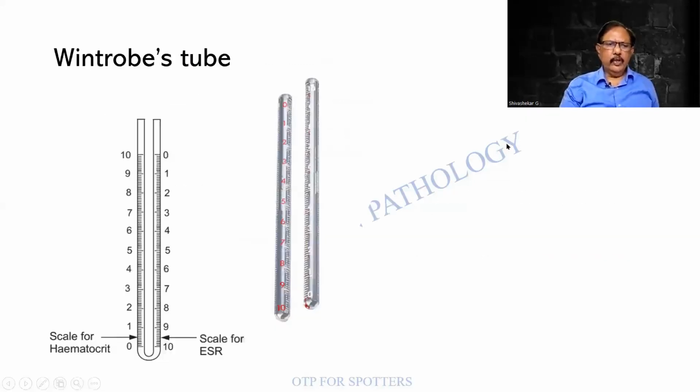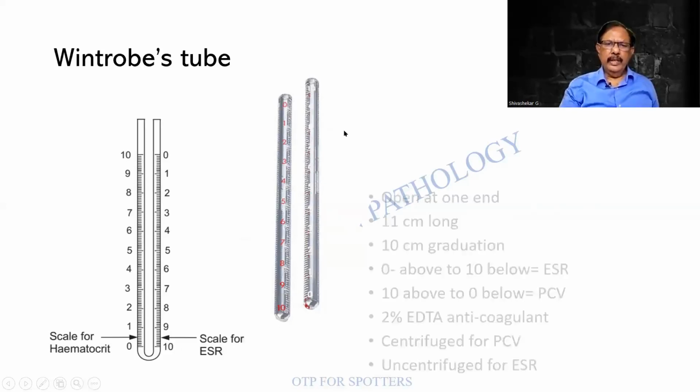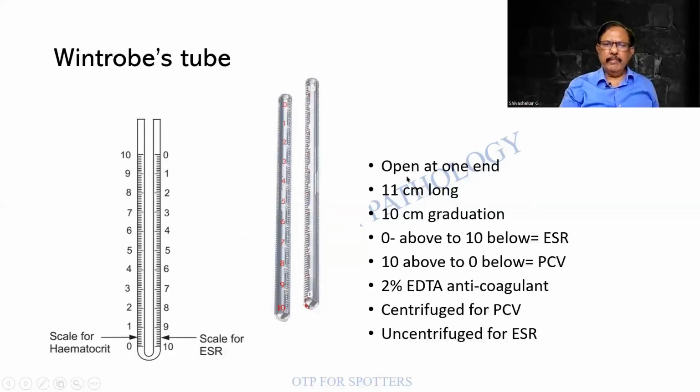So this is another tubular structure. If you are very careful, you will observe that there are two sets of readings over here. 0 to 10 is for ESR and 10 to 0 is for hematocrit or PCV. This is what you people will be seeing. There are the graduations and the tube is quite narrow. It is filled in by means of a Pasteur pipette.